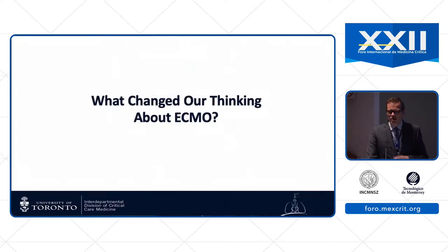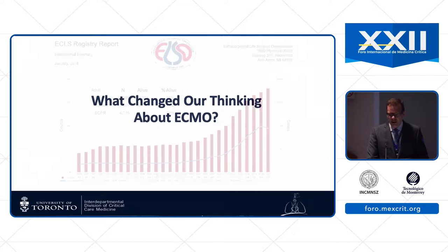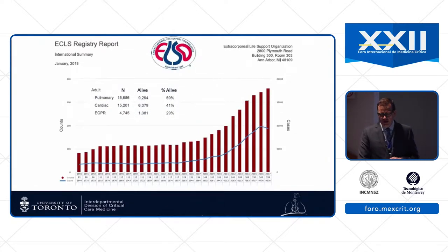So what changed our thinking about ECMO? And let me tell you, our thinking has changed. This is the report from the ELSO registry in the United States, collecting data from all over the world, though. You can see, whether you're talking about the number of centers that are doing ECMO, the red bars, or the number of cases of ECMO, the number of runs that are happening, in adults for respiratory failure, a huge increase in the last decade, rising exponentially.